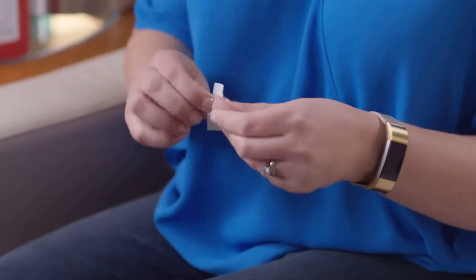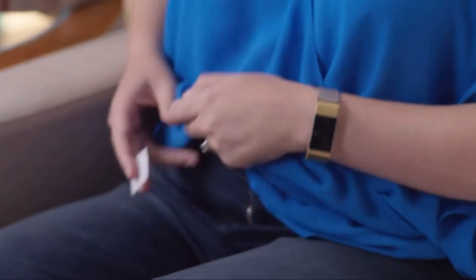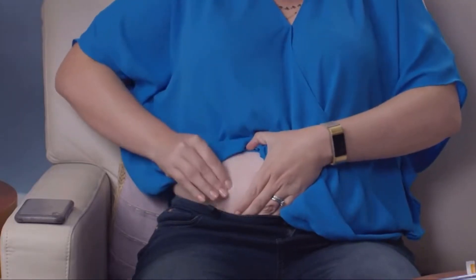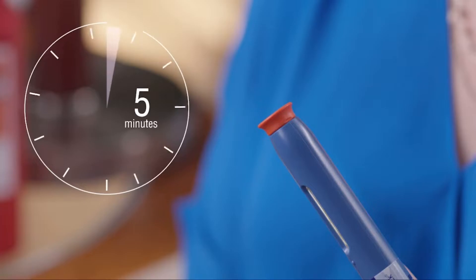Remember that if you want to do it in your upper arm, you need to have somebody else give you the injection. I like to give the injection in my stomach. The first thing that you need to do is clean the injection site with an alcohol pad. When you're ready to inject, take the cap off. Remember that after you take off the cap, you have to give the injection within five minutes. If you don't, the needle may dry out and the injection may not be successful.